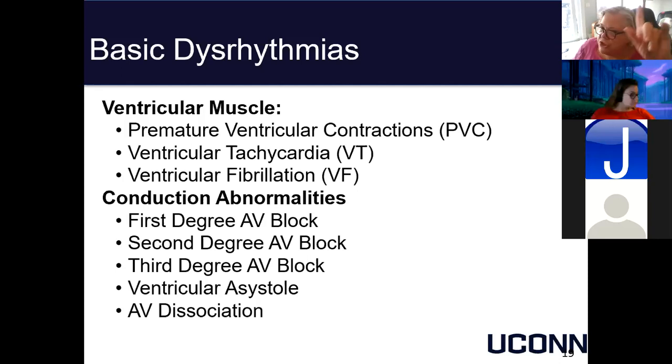Ventricular fibrillation, just like with atrial fibrillation, means your ventricle is completely disorganized. This patient has no discernible pulse, has no discernible blood pressure, and ventricular fibrillation is a non-life sustaining rhythm. It is a full-out emergency. But you have cardiac activity, which is important to note. Do you see the difference between ventricular fibrillation and everything else we've talked about so far?